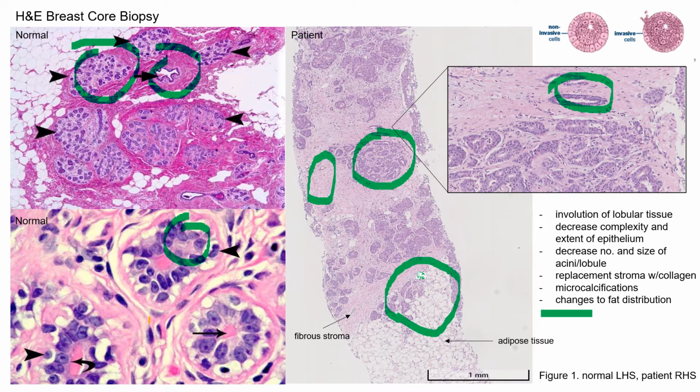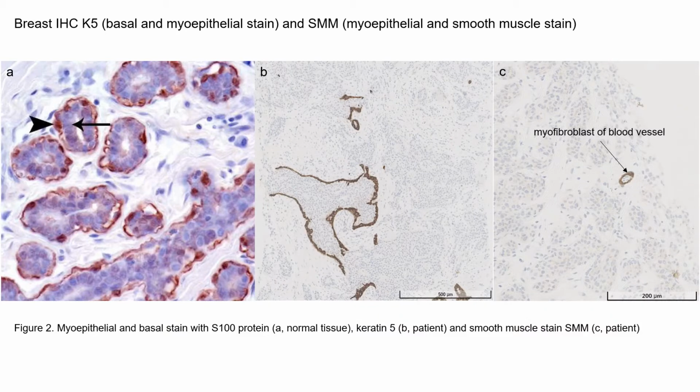When the lump is non-mobile, as in this case, it suggests infiltration and metastasis into surrounding tissue and distant organs through lymphatics or blood vessels. The extensive desmoplasia distinguishes invasive ductal carcinoma from other breast cancer subtypes like invasive lobular carcinoma, which will have a minimal fibrous response. On the normal immunohistochemical staining, we see a complete layer of myoepithelial cells surrounding the duct.